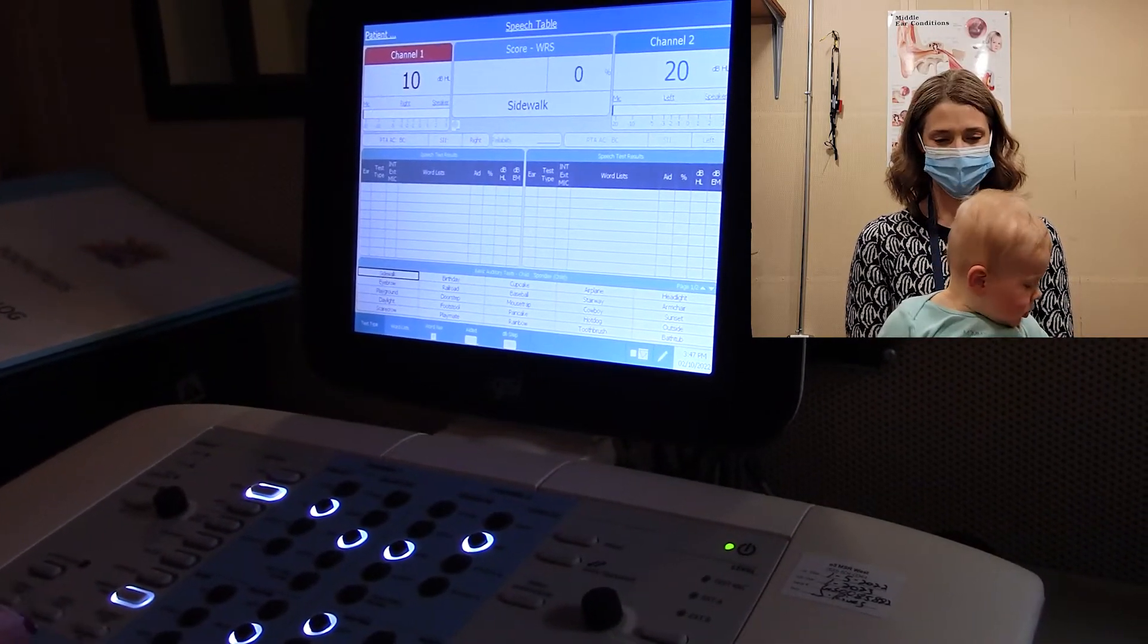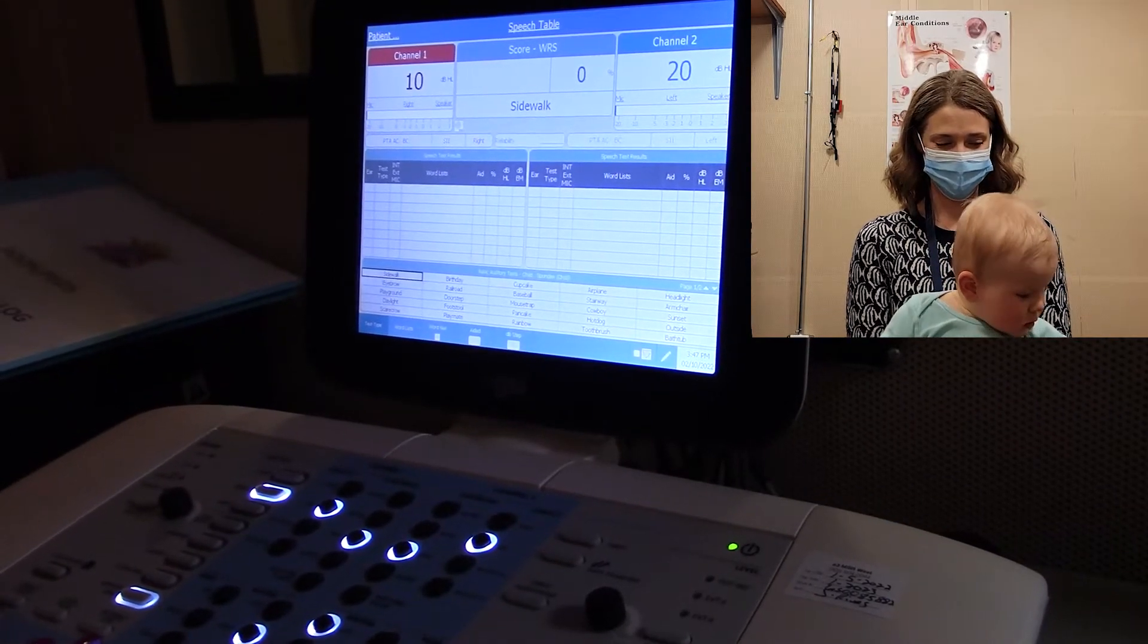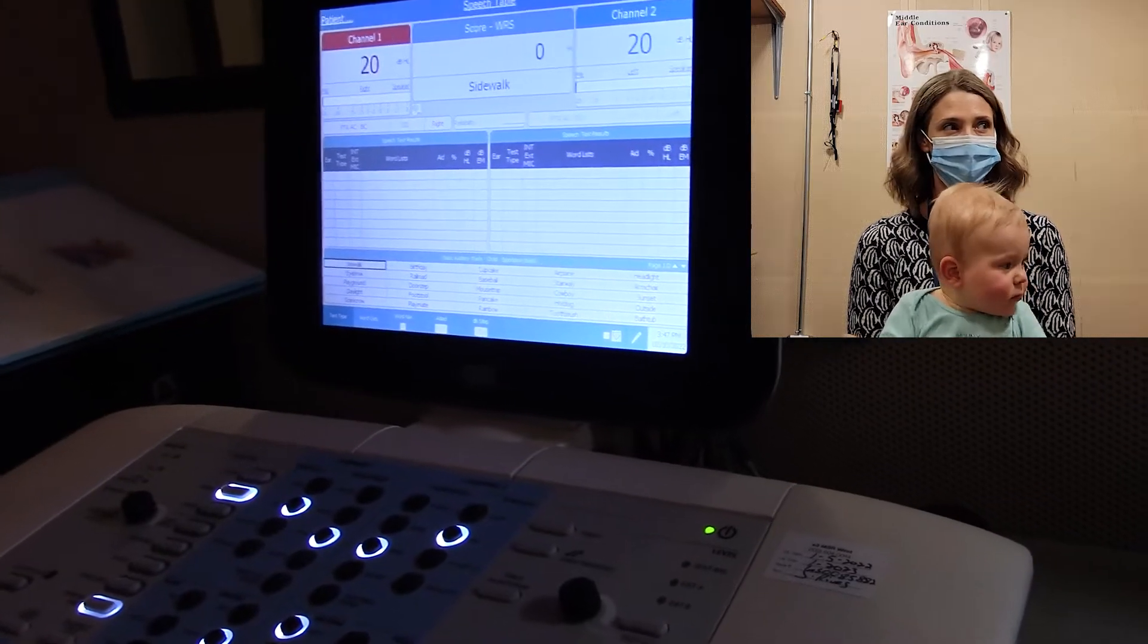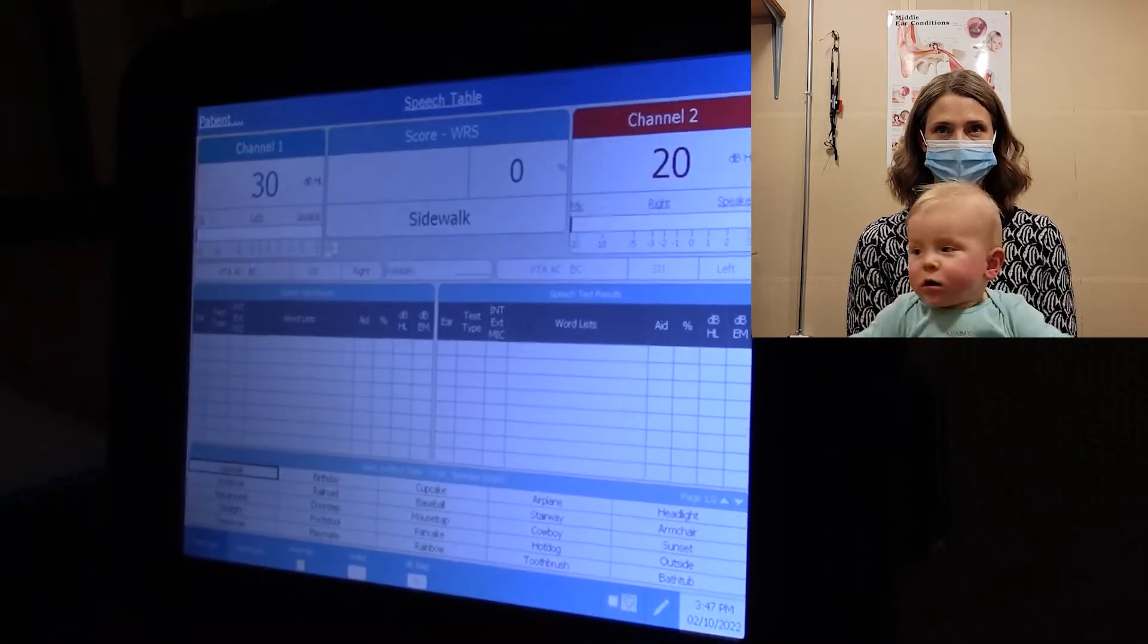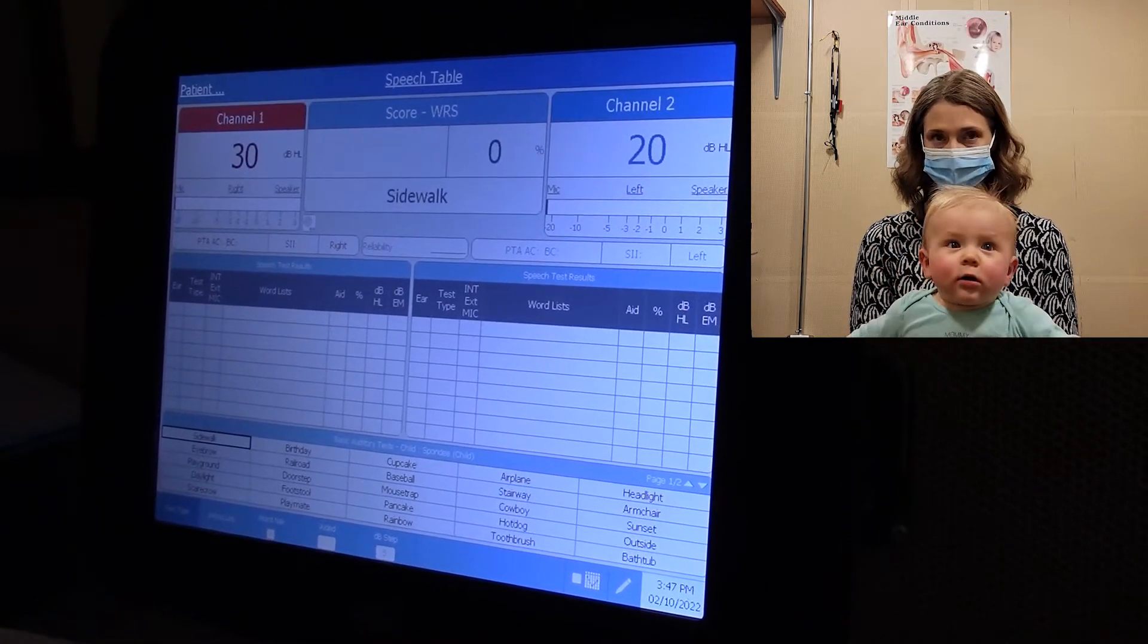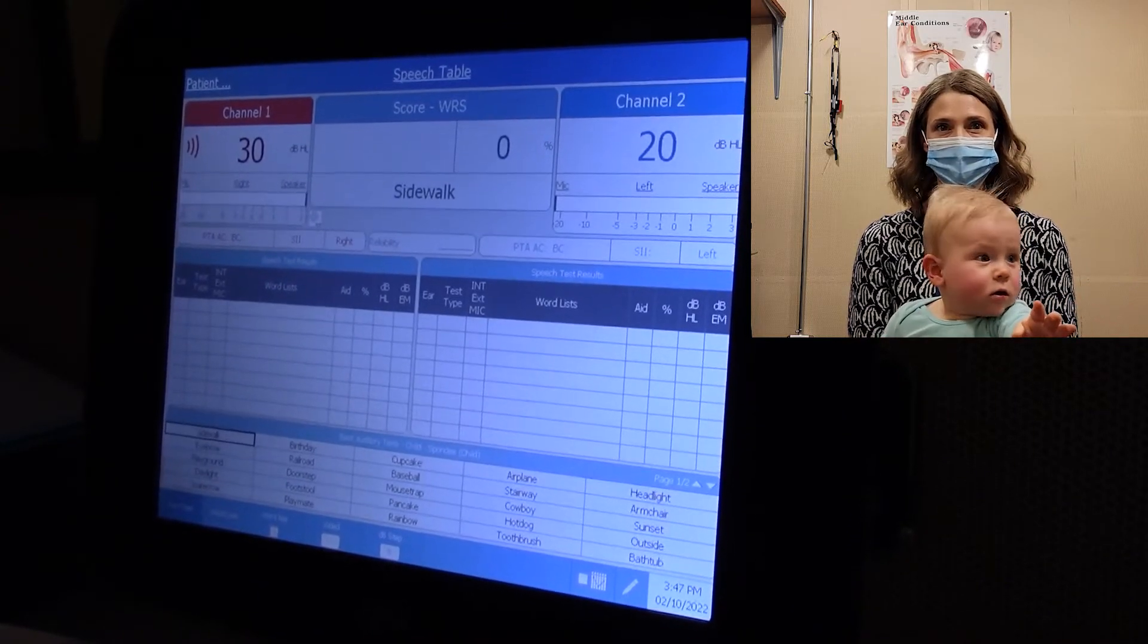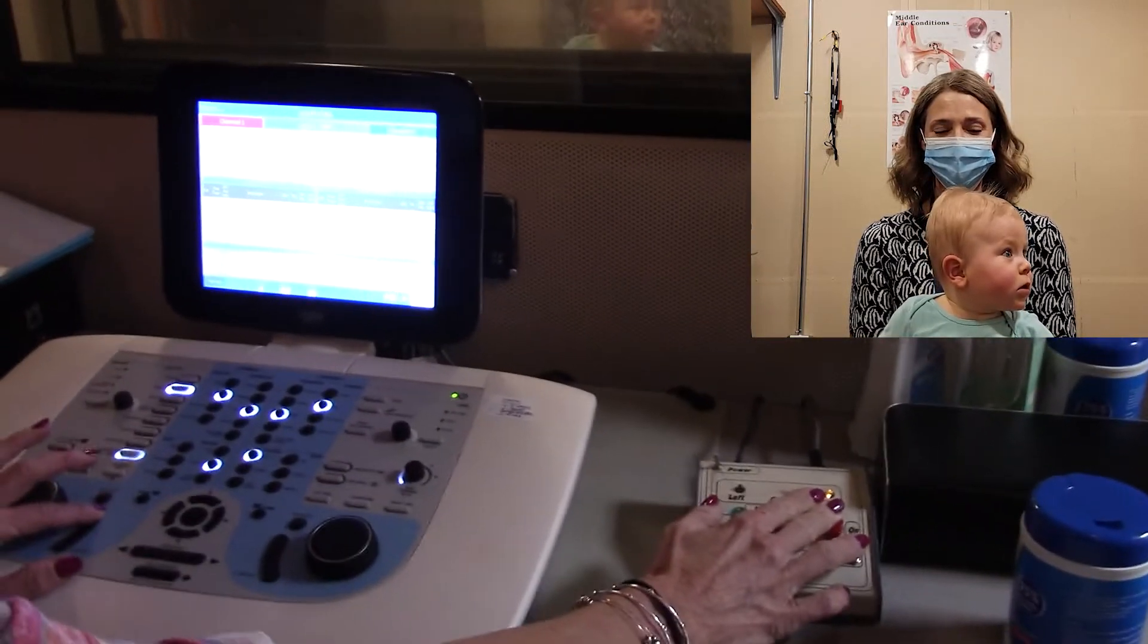I just turned it off. I think that he responded. I'm going to go a little bit louder, up to 30. I think I got him a response of 10. So I'm going to go up to 30. I'll switch speakers to the right. And presenting. Over here Connor, what's going on? Hello there.